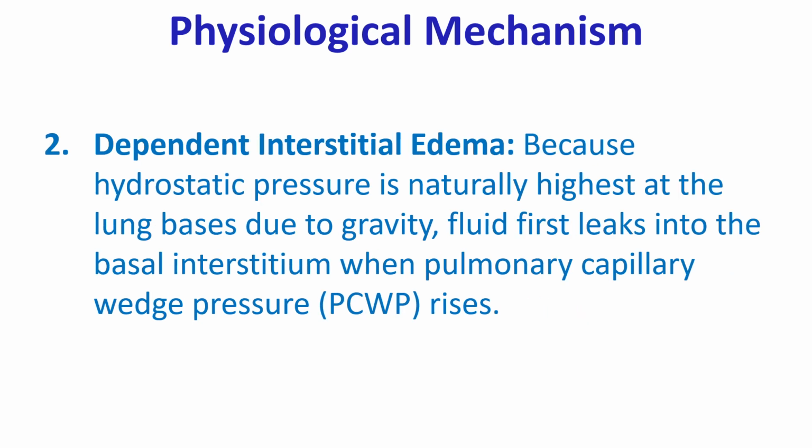2. Dependent interstitial edema. Because hydrostatic pressure is naturally highest at the lung bases due to gravity, fluid first leaks into the basal interstitium when pulmonary capillary wedge pressure rises.